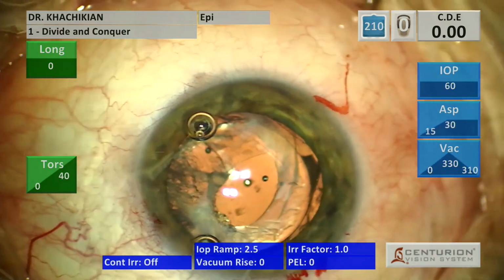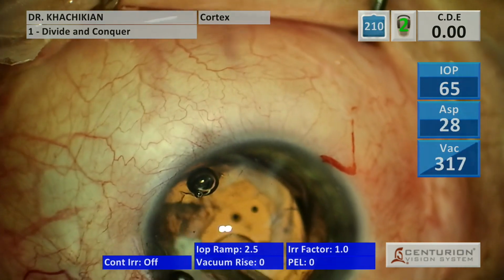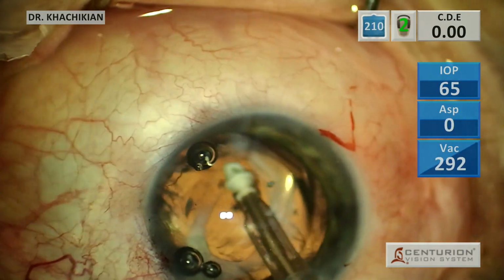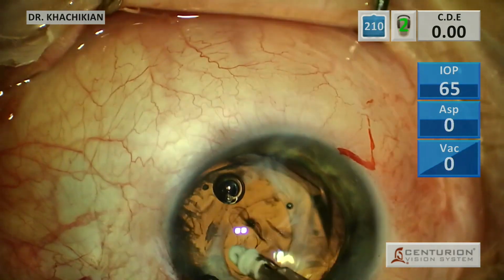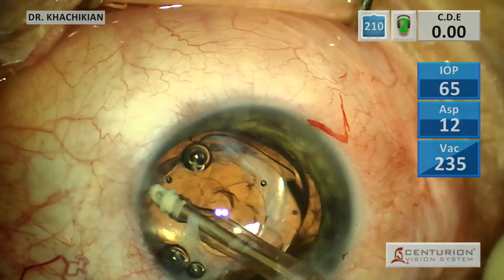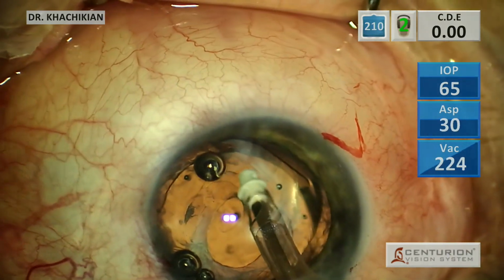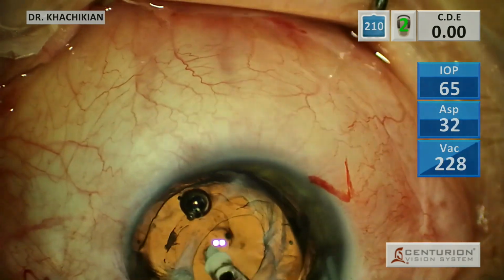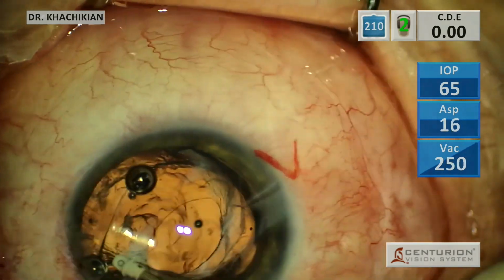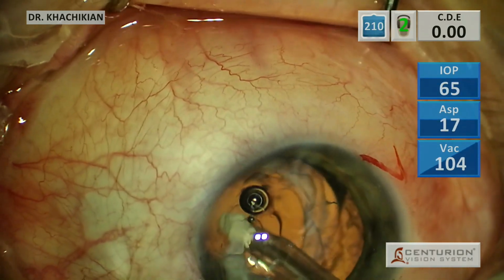But we've opened up the lens capsule with viscoelastic. Now we're going to go in with IA, and we're going to get rid of that cortex. Why? Because I can't really see what else is going on. I really want to be able to identify where the capsular bag is phimotic. Where is there just retained cortex? Is the capsular bag open to the capsular fornix? Like, what's going on here? Where is this lens being held up in specific areas so that I can just address those areas?